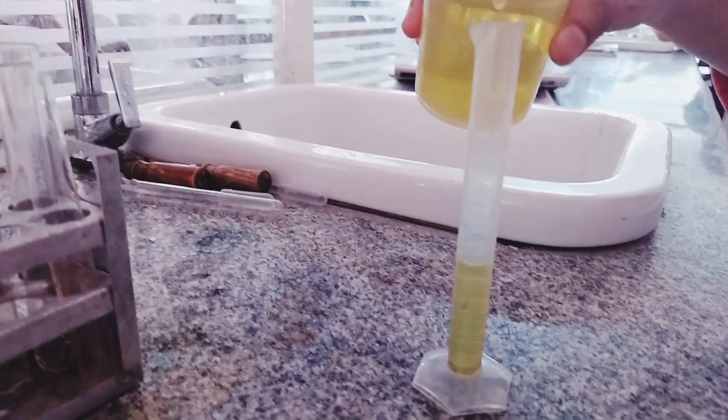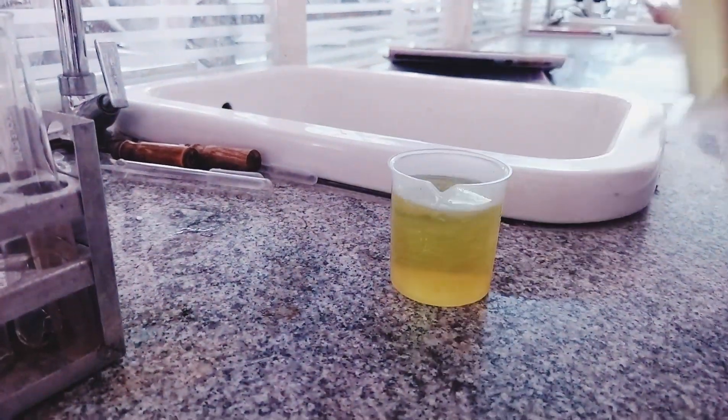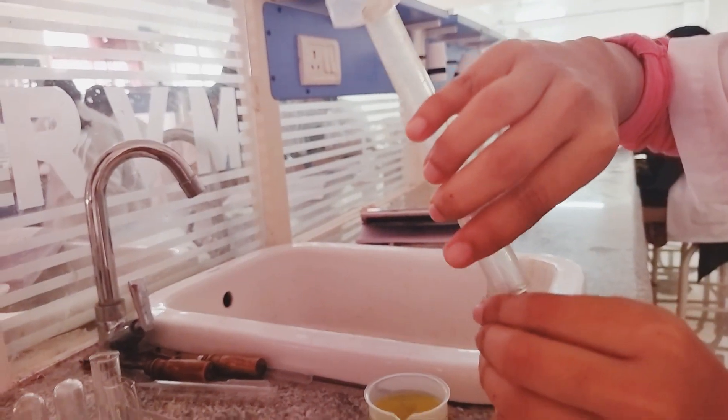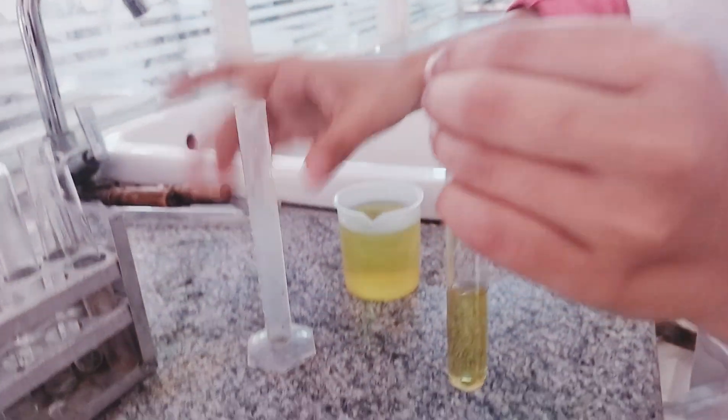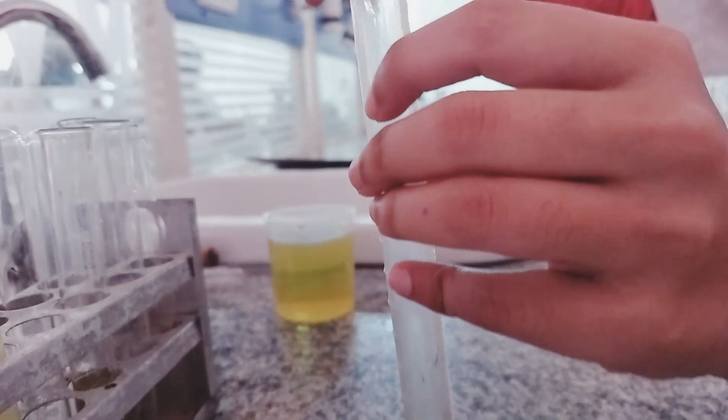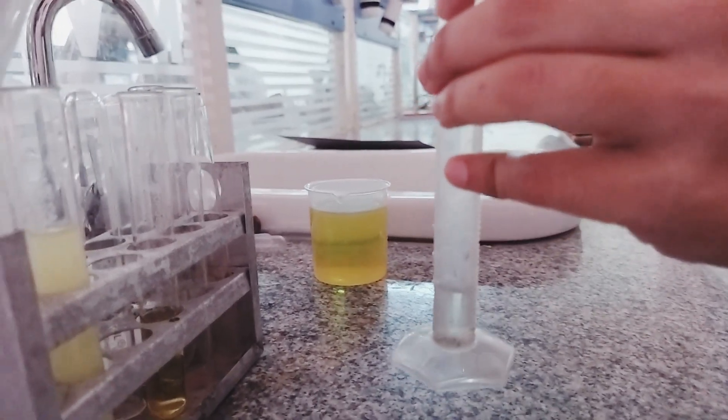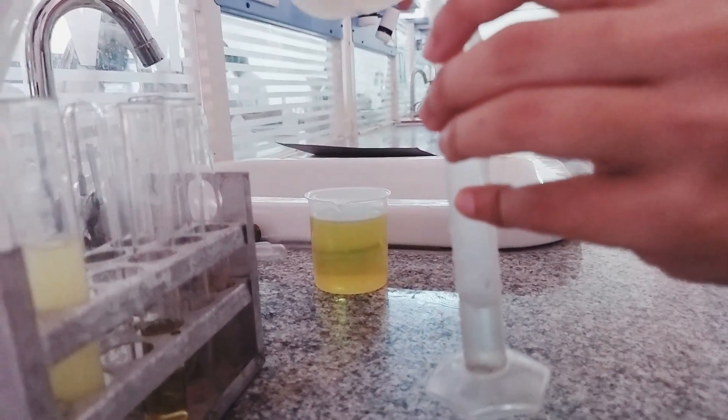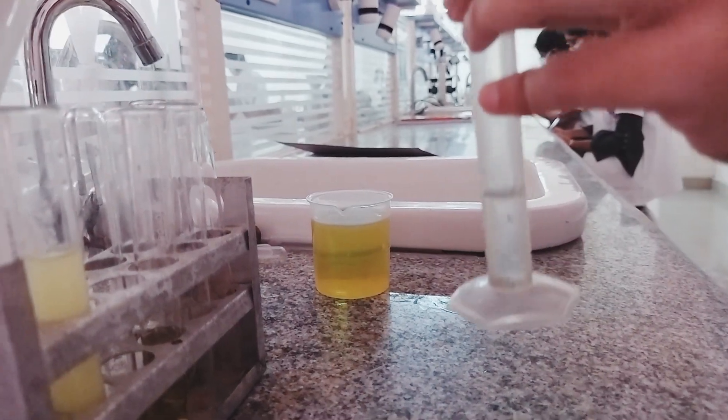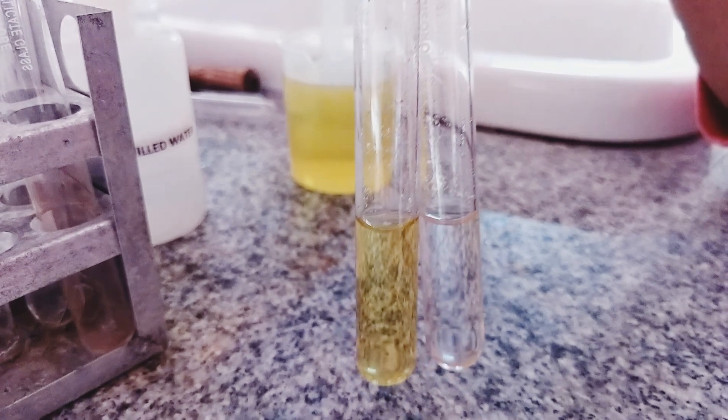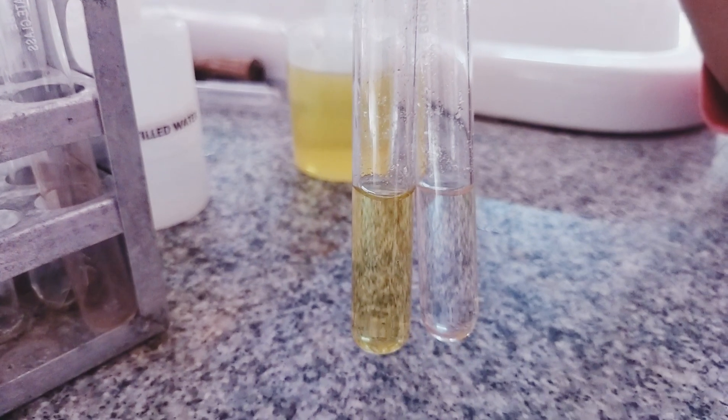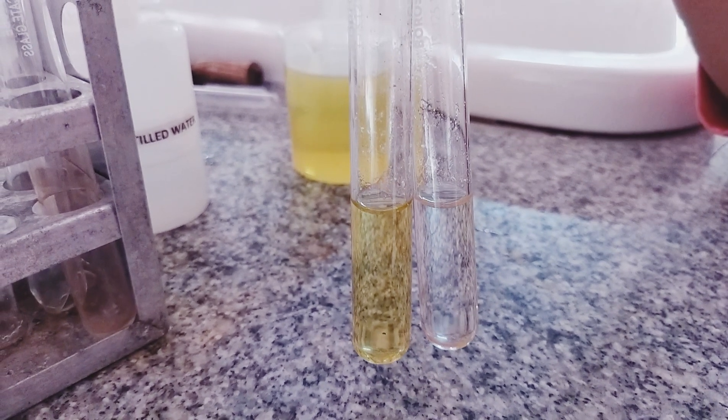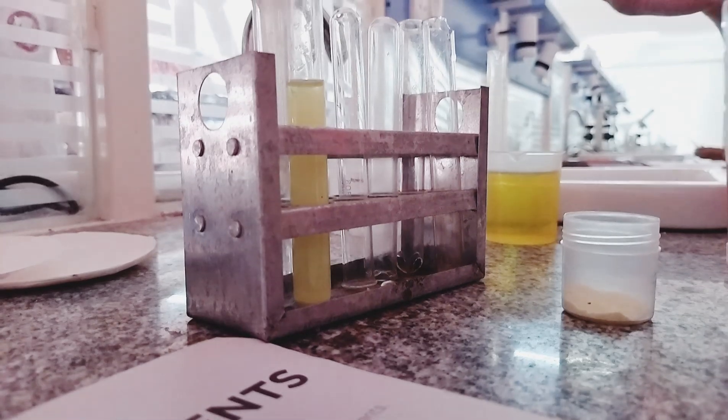In the demonstration video, we are taking 5 ml of urine sample in a test tube with the help of measuring cylinder. Now, we are adding the distilled water in the measuring tube and we are transferring this distilled water into a test tube. So, this is the sample collection. The yellow one is with urine sample and the white colorless one is with distilled water.